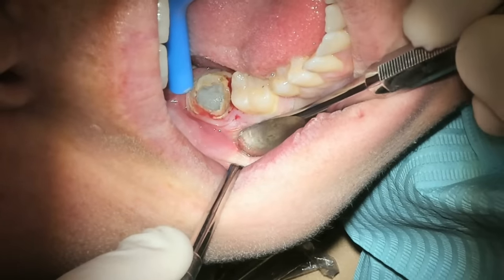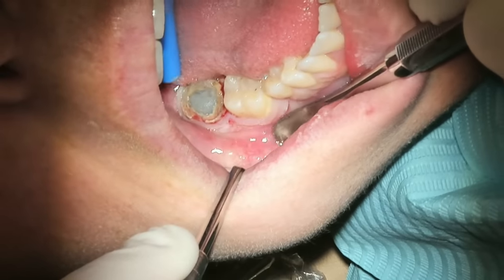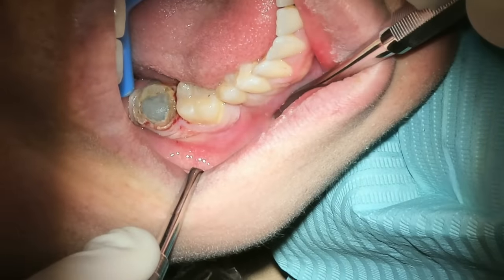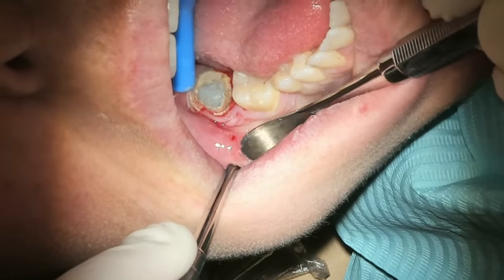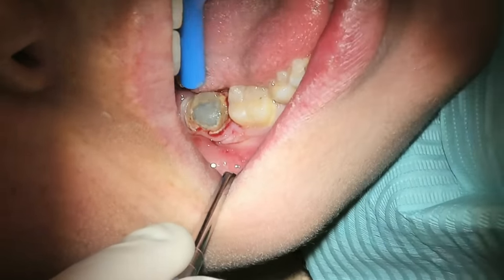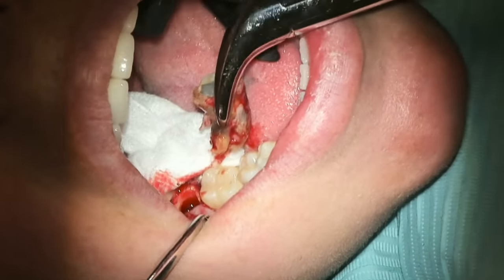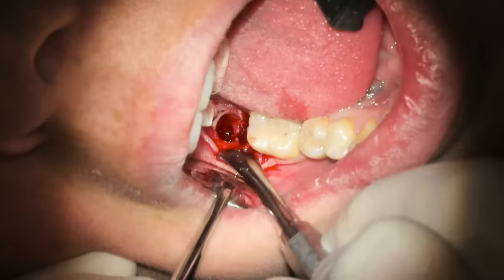After we remove the source of infection, we clean out the area very well and we make sure to leave an open wound. The reason why we want to leave an open wound is so that if there is any purulence left, that purulence can actually drain out of that site. That's important because we want that area to drain out as much as possible.